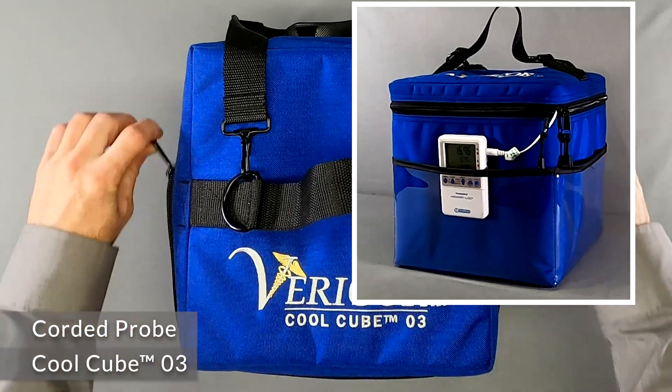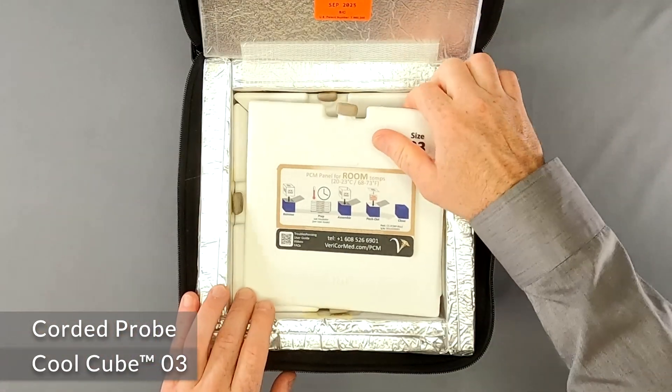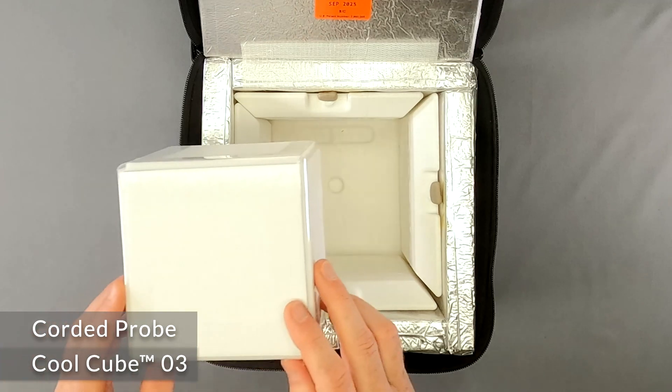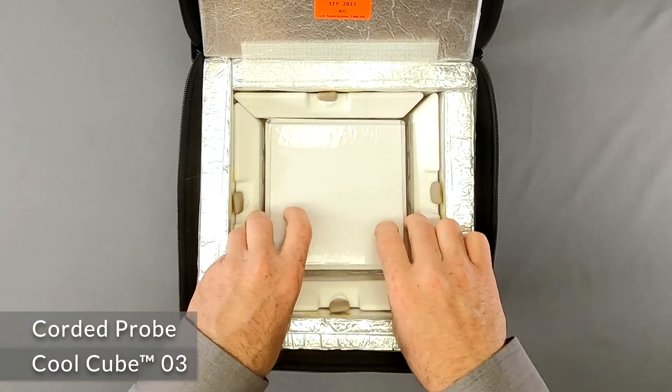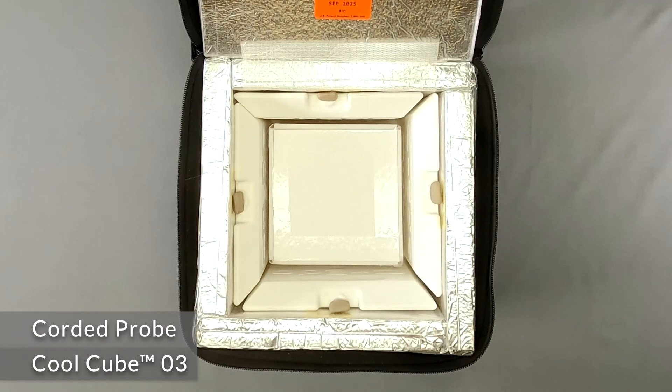Routing a corded probe through the CoolCube O3. The CoolCube O3 has clear plastic external pockets for holding a temperature monitor or other things during use. When using a device with a corded probe, here's how you can do it.